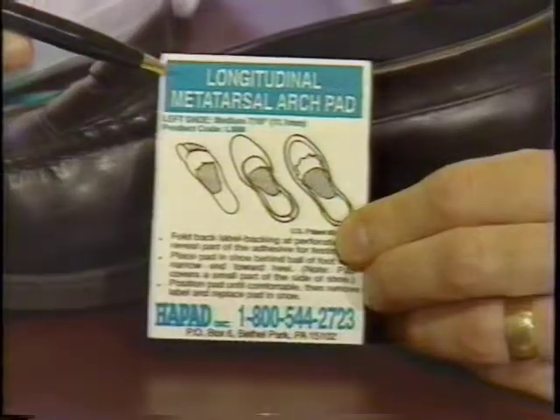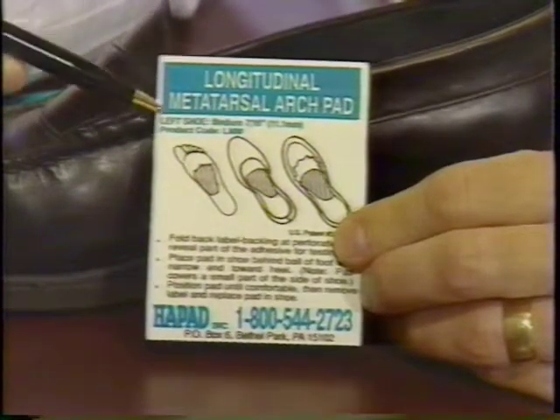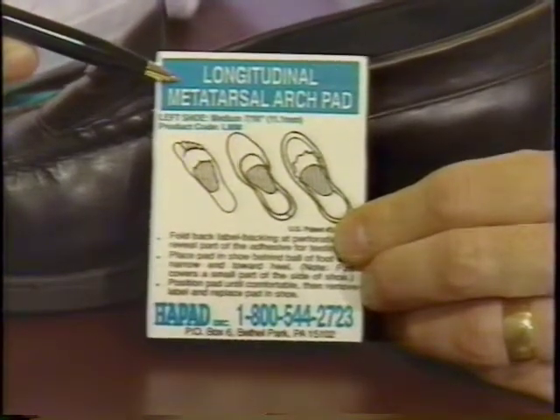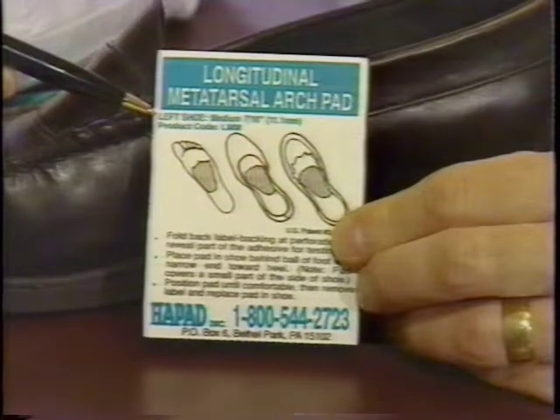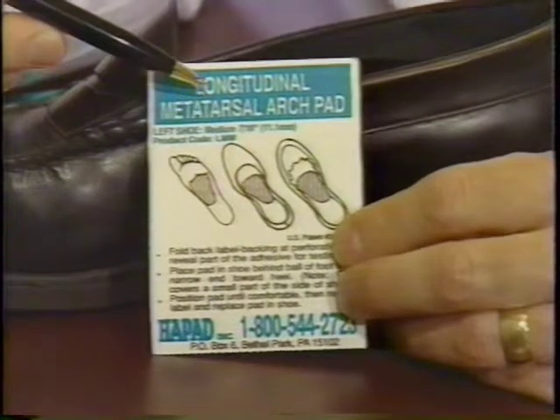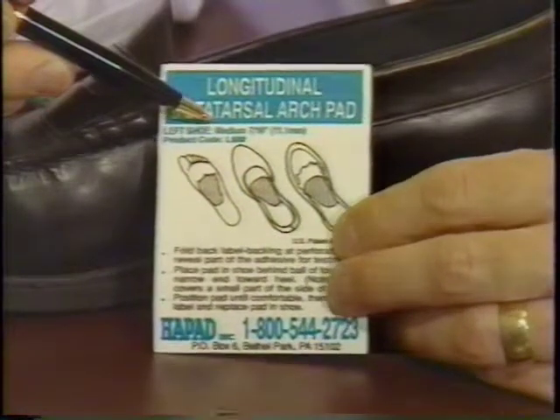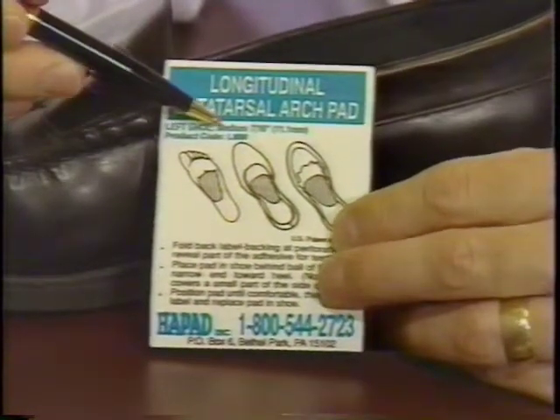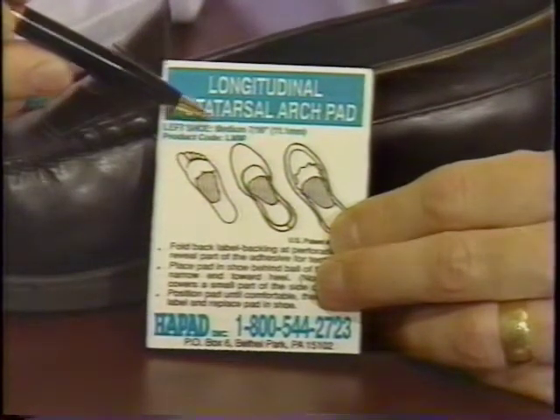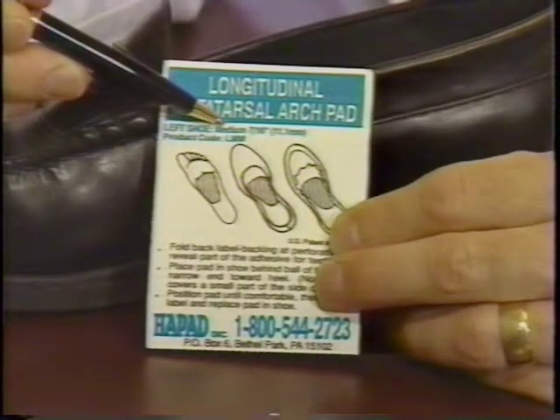There's some important information on the wrapper that can help you with purchasing more of these pads. At the top is the actual name of the product — in this case, a longitudinal metatarsal arch pad. The next line tells you whether it's for a left shoe or a right shoe and the actual size. Sometimes after using these pads for a while, a patient will decide they need a thicker or thinner pad, and there are various sizes and shapes available — medium, large, extra large, small, and extra small — depending on what feels best for your foot.